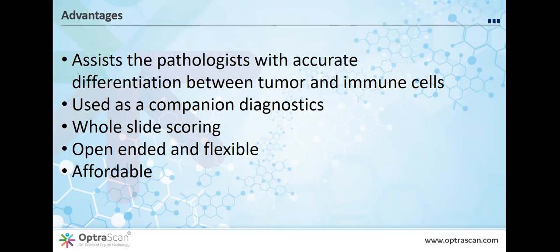And that's been demonstrated in other areas of digital pathology. There's a study called the Chameleon study that Google has been running. You can Google it and look it up, where they show that in morphologic identification of metastases of breast cancer in lymph nodes, you could train an algorithm by deep learning within a relatively limited slide set, a lot of images to look at, and it would then match and beat the pathologists, getting 96 or 97% right versus pathologists at 94% right.